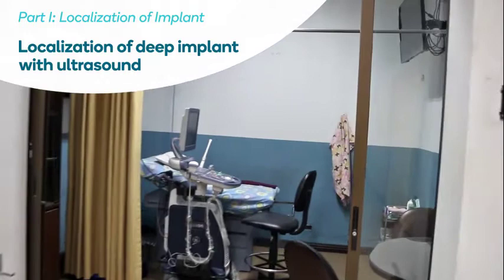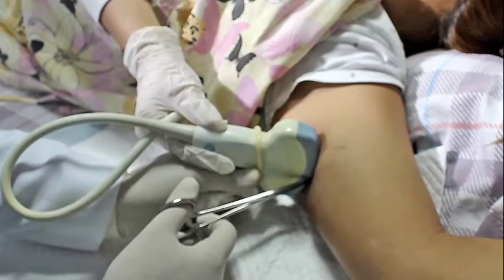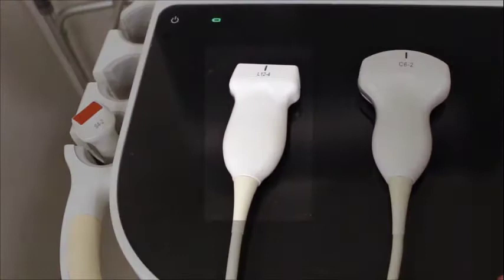If the ultrasound exam cannot be done in the clinician's suite, the clinician should accompany the client to the ultrasound exam in order to verify implant location for subsequent removal. The clinician may work with the sonographer for the removal under ultrasound guidance, or the clinician may complete localization and removal individually. If available, it is optimal to use a linear array probe with a high range of frequency from 10 to 18 MHz with a sterile probe cover.